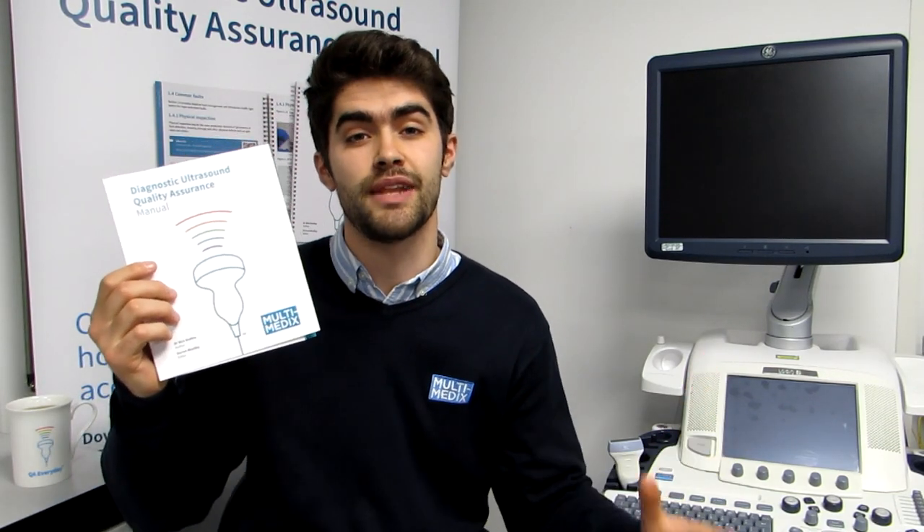If you do find dropout in your own probe or any other faults with your probe or scanner, you can have a look at the Multimedics QA manual to know what to do next. Or you can get in contact with us by giving us a call or sending us an email.